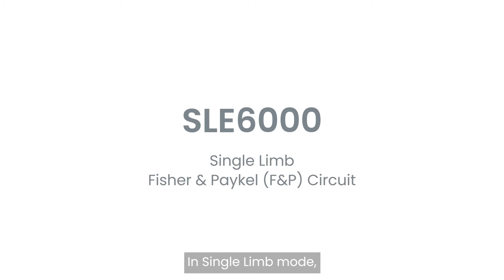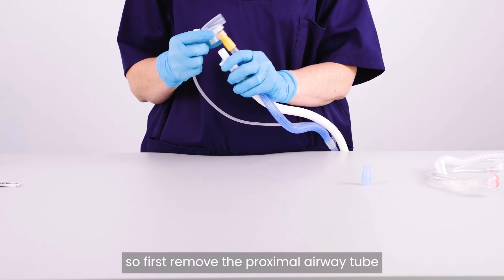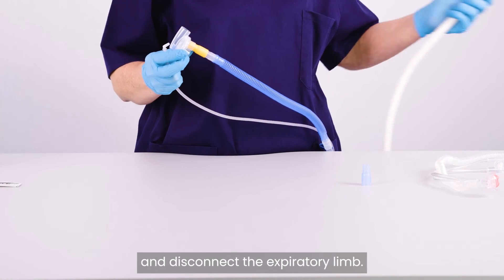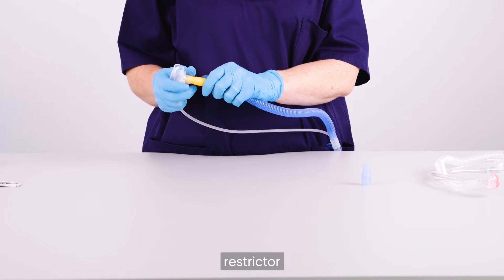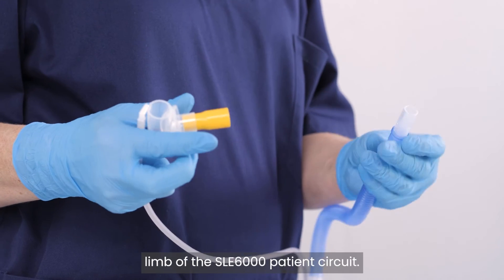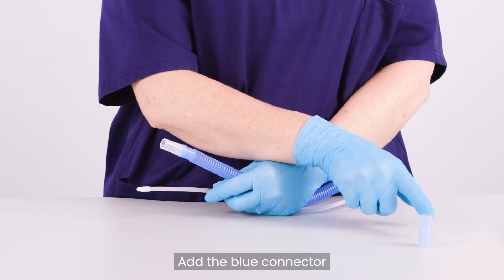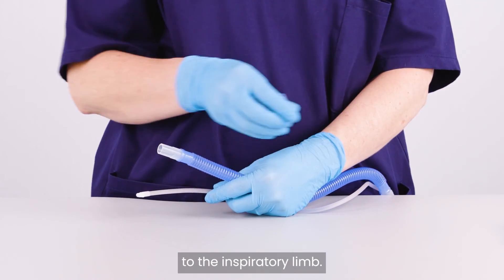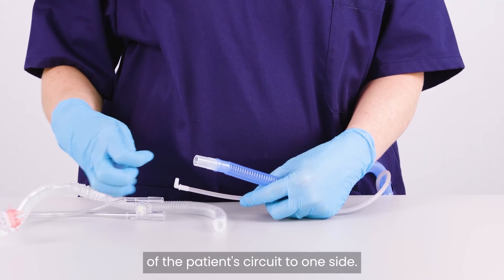In single-limb mode, the expiratory limb is not used, so first remove the proximal airway tube and disconnect the expiratory limb. Disconnect the tube that contains the yellow restrictor from the rest of the inspiratory limb of the SLE-6000 patient circuit. Add the blue connector to the inspiratory limb and put the remaining part of the patient circuit to one side.